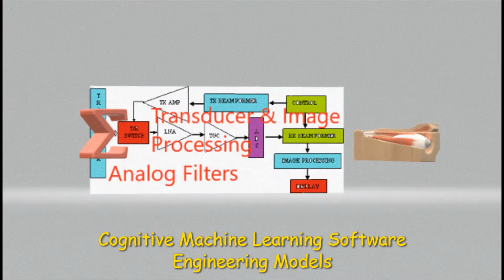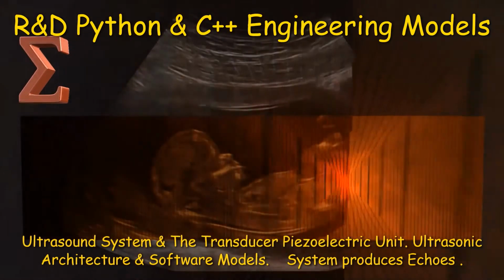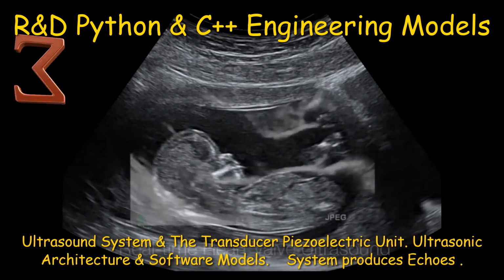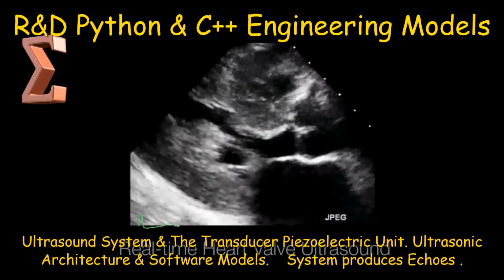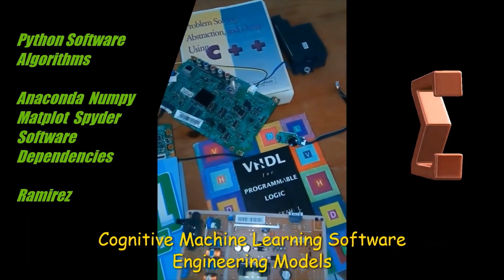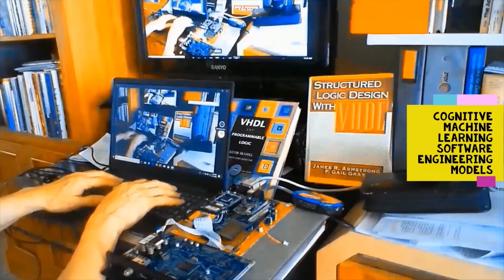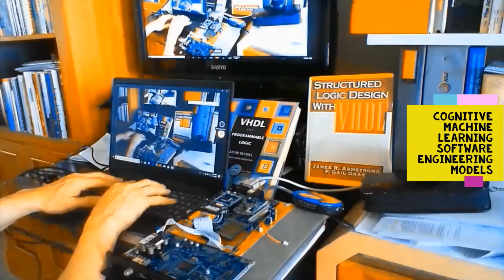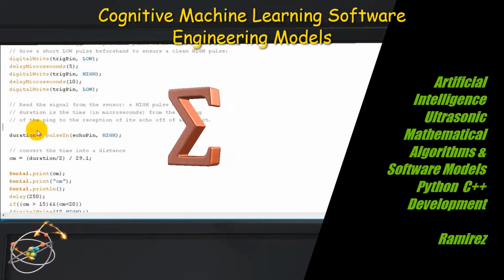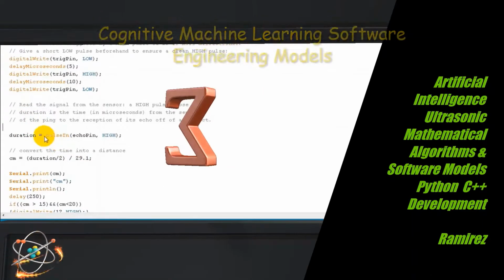The system architecture requires a pulsar system to enable the transducer to emit a signal, a high voltage pulse, which is precisely controlled in amplitude and in time, and it needs to reach the transducer. The subsystem also requires an analog processing unit.